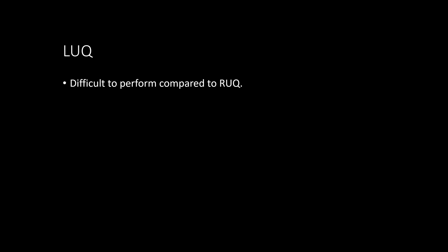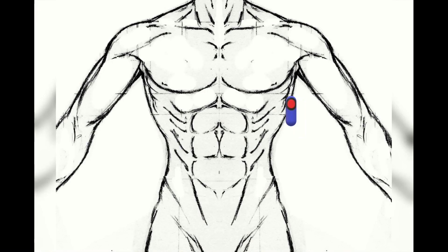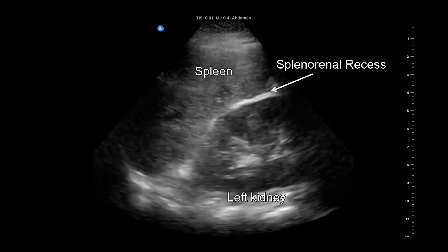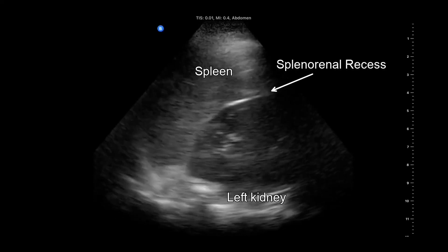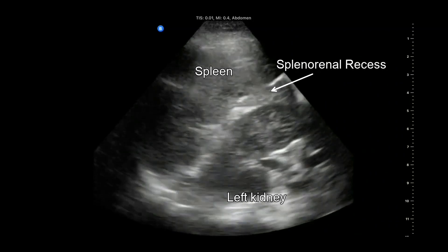The left upper quadrant or perisplenic view can be challenging to obtain because the spleen does not provide as large a sonographic window as the liver, and the examiner frequently needs to reach across the patient to access the left upper quadrant. Ideal placement of the transducer is generally more cephalad and posterior than in the perihepatic view. A good starting point is the posterior axillary line at the 9th and 10th intercostal space. Free fluid in the left upper quadrant collects differently than in the perihepatic area, primarily because the phrenicocolic ligament restricts fluid from filling the splenorenal interface.